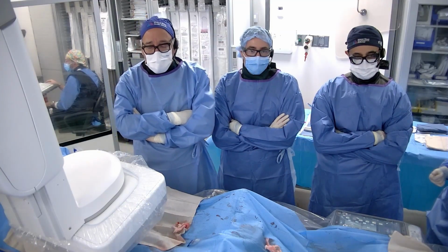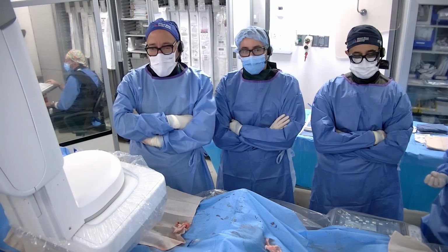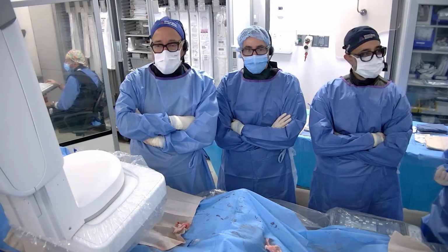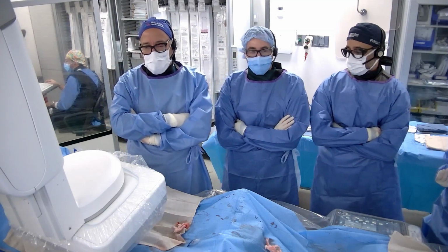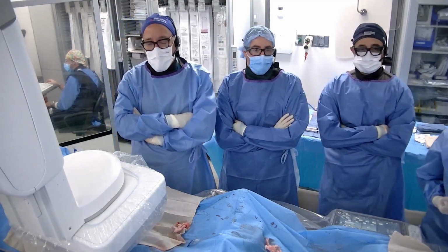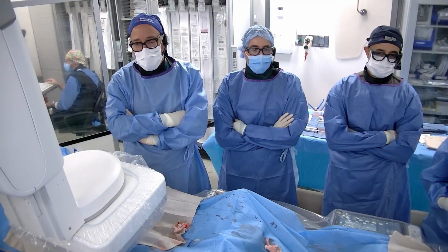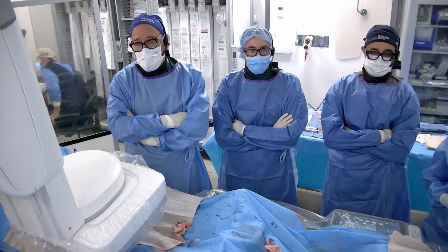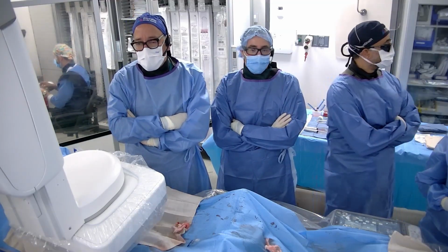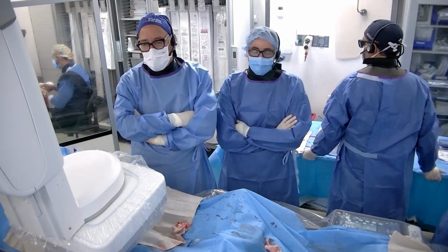And then the goal is going to be just optimizing the entire FemPop segment. My clinical goal is that before we exit the patient, he has a palpable PT pulse. And that's what I'm going to use to sort of end the case, regardless of what the angiogram looks like. If I can get the pulse pressure in his foot to about 70 or 80 millimeters of mercury, and I can feel the pulse in his foot, I think that's a durable result. I think he's going to clinically benefit from it. I'm hoping it doesn't take more than 1 or 2 scaffolds, but we're obviously going to be prepared to give him the most durable result that we can.